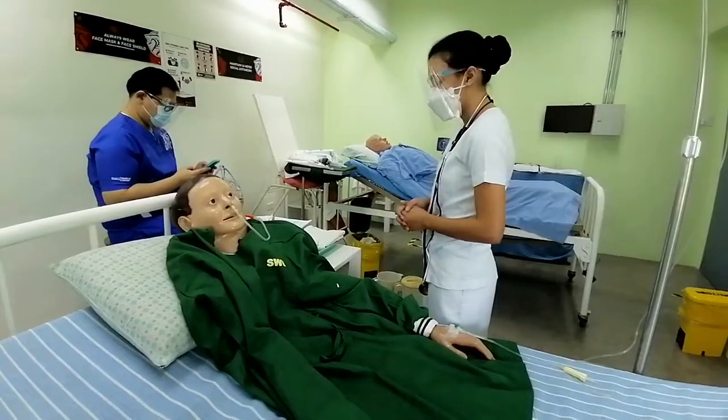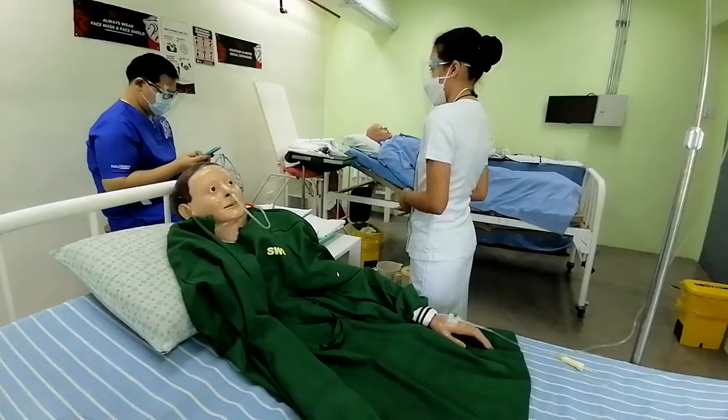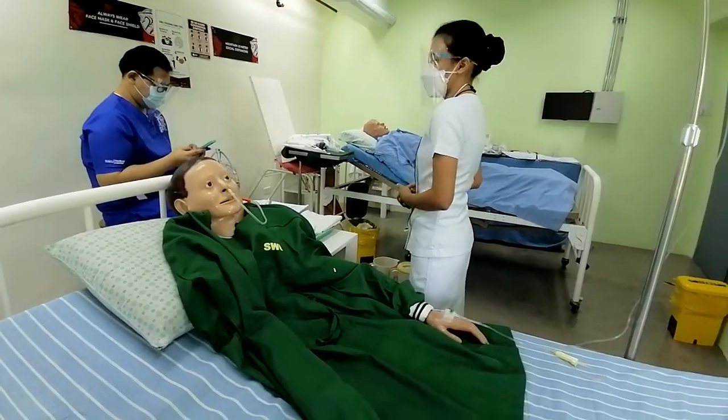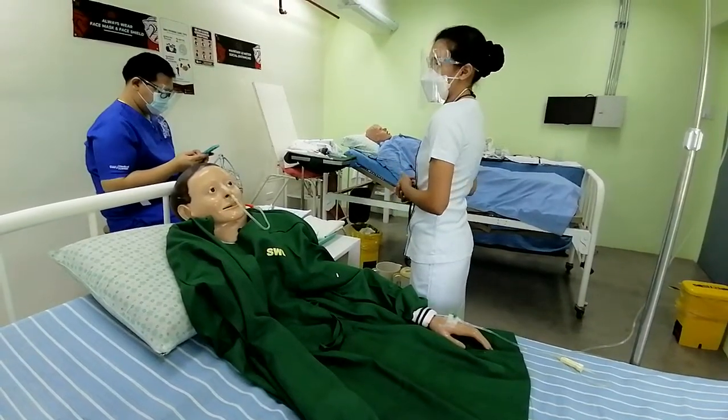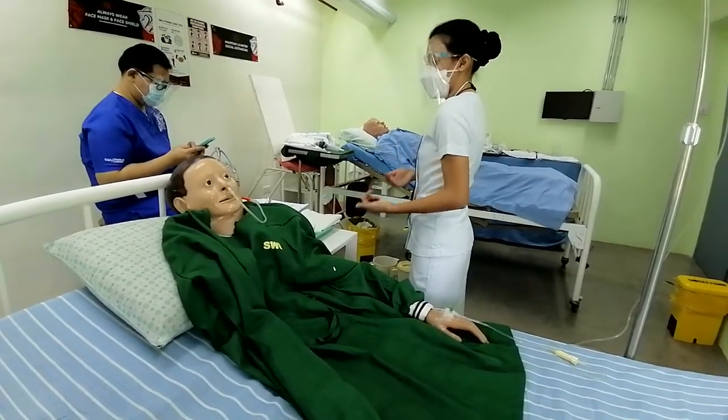After that, I will verify the physician's order. I will check the chart and verify it. The purpose of that is that the physician's order is a go signal for us to perform the procedure.